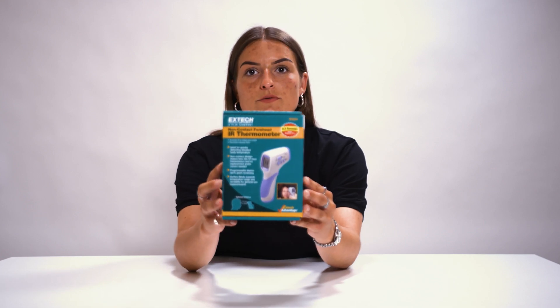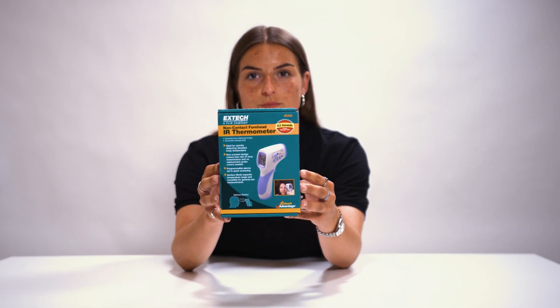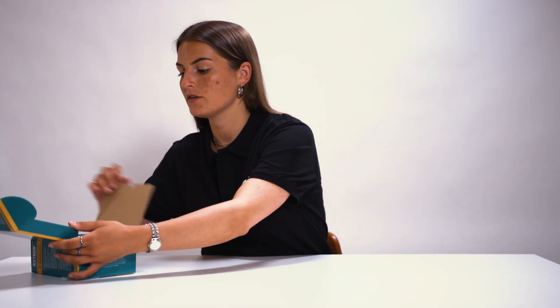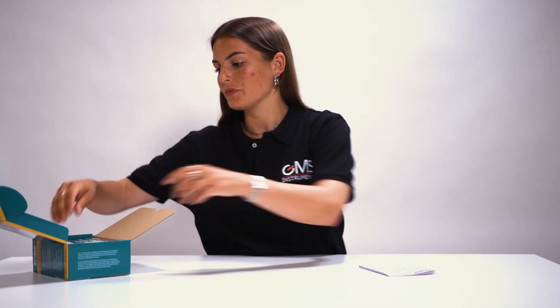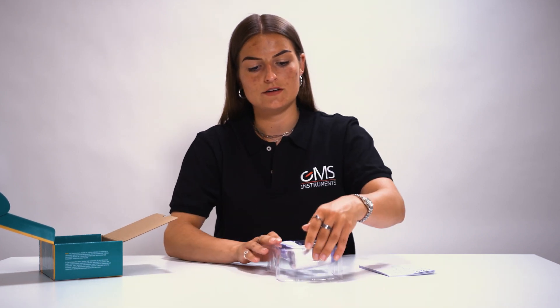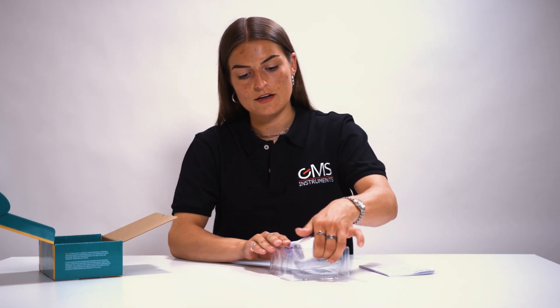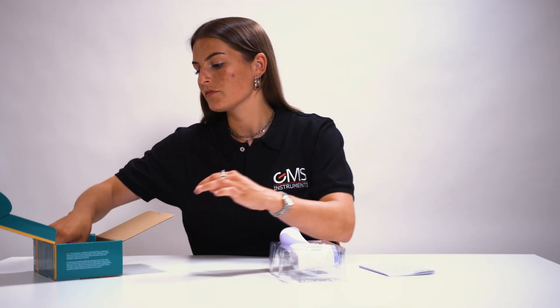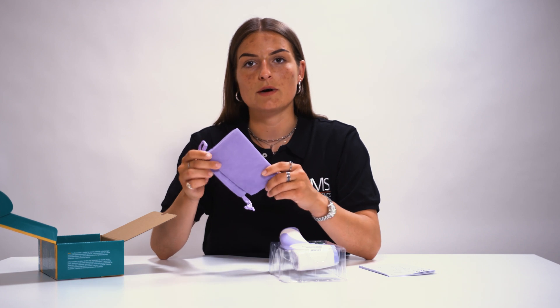When you receive the IR200 forehead thermometer, it comes in this box. Let's first check out what's inside the box. Of course, you get a user manual, 2 AA batteries included, and the infrared thermometer itself. And this pouch.